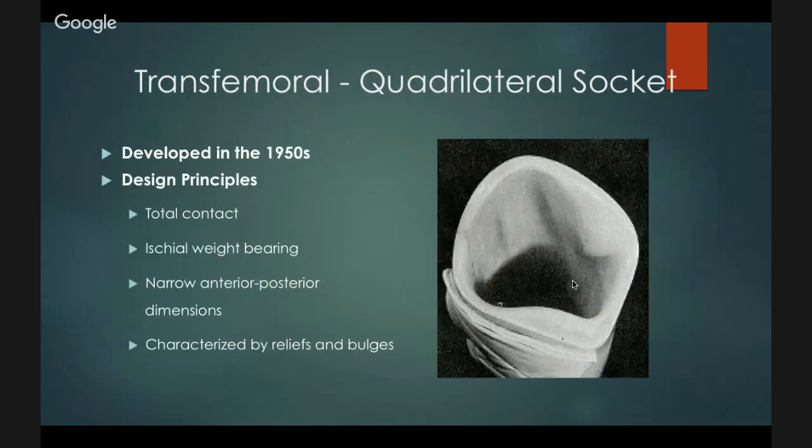The problem with the transfemoral amputation, and I just realized I skipped over knee disarticulations, but anytime you cut through the bone, you're not meant to distal end bear, because that's not how the bone is designed. Anytime you have the full length of bone, the advantage is you can put a good amount of weight through it, because that's how the bone was designed. You cut through the femur, and now you have this sharp, bony, small surface, and it can cause a lot of pain. It can punch through the soft tissue and cause skin breakdown. So the idea with the transfemoral, and with the transtibials, is that you need to find a way to offload that distal residual limb so you don't get too much pressure there. And so how do you do that?